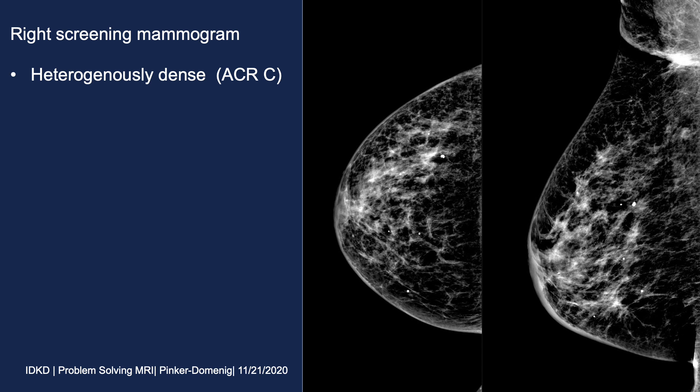This is her right mammogram, which was read as normal — I personally agree with this assessment. We see a few benign calcified cysts, but there are no evident asymmetries, masses, or suspicious calcifications, so this was read as normal.